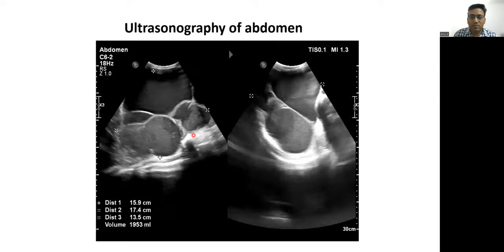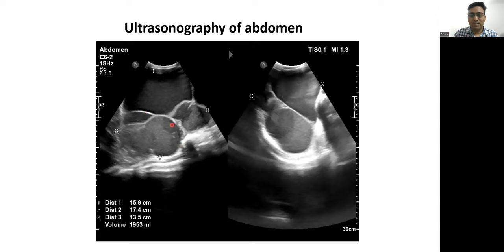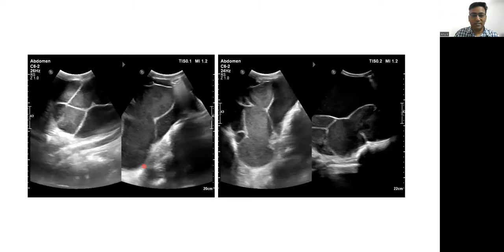We performed ultrasonography of the abdomen and found a large cystic lesion extending from the right side of the diaphragm to the right pelvis, measuring approximately 16 to 17 by 13 centimeters — very large, occupying almost all of the abdomen. This cystic lesion contains multiple thin septa which show no vascularity on color Doppler. The cyst has low-level internal echoes, no abnormal calcification, and no mural nodule is appreciated.